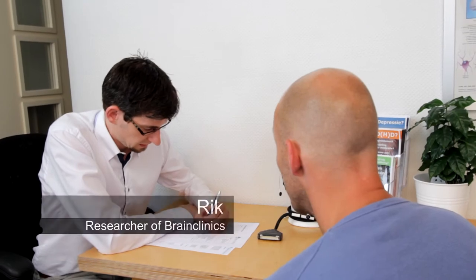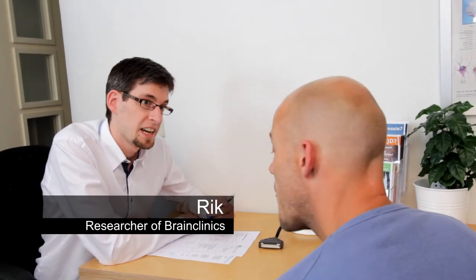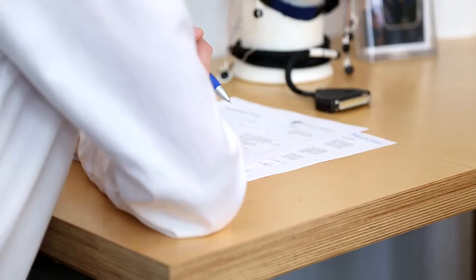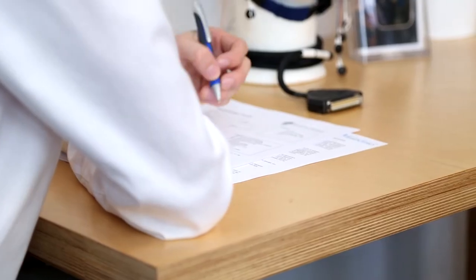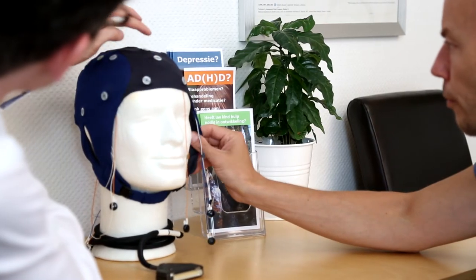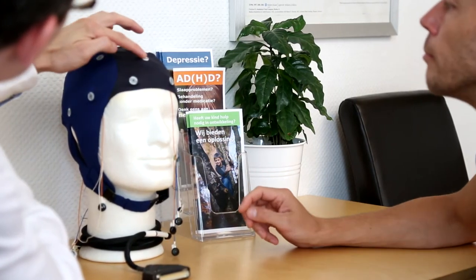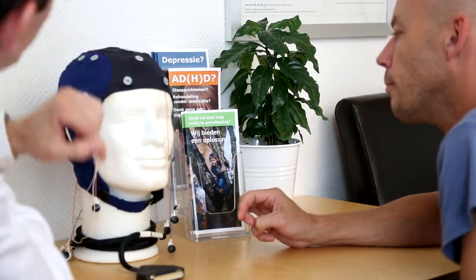First, a brief conversation takes place between the researcher and the client. During this conversation, the researcher will explain the procedures of the QEEG assessment. The client is then asked to complete a number of forms.